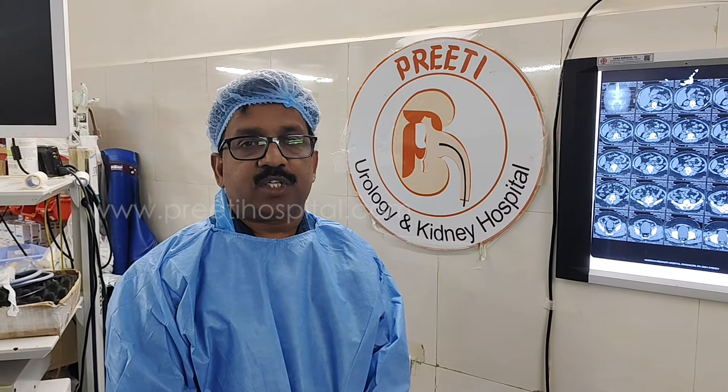Dear friends, urologists, we are planning to do RIRS in large volume stone. For a large volume stone, which conditions make RIRS not feasible or feasible — there are no definitive guidelines.